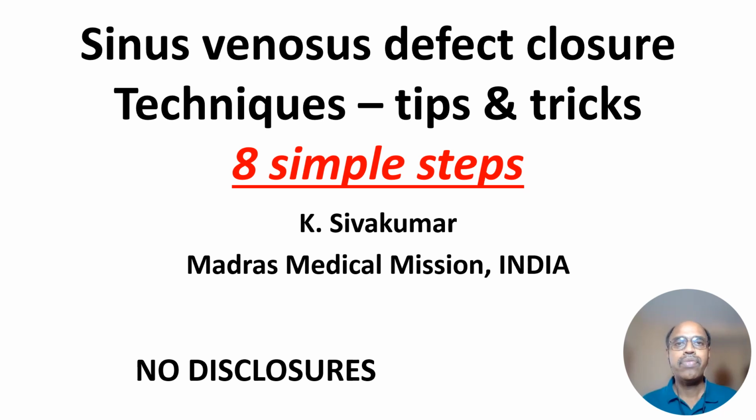Good morning. In this brief lecture, we are going to be discussing sinus venosus defect, non-surgical correction using balloon expandable covered stents. I will simplify the procedure into 8 simple clinical steps.